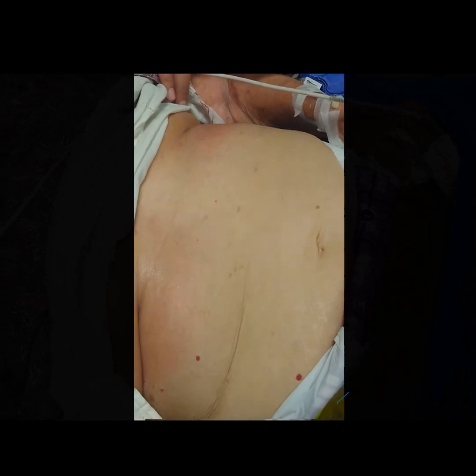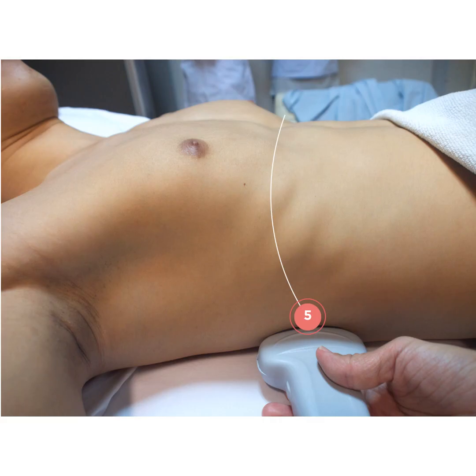We suspect that maybe she has diaphragmatic paralysis, because she's trying to use her abdominal muscles so much when she breathes in. So basically, we performed bedside diaphragmatic ultrasound in different views to assess appropriate diaphragmatic function.